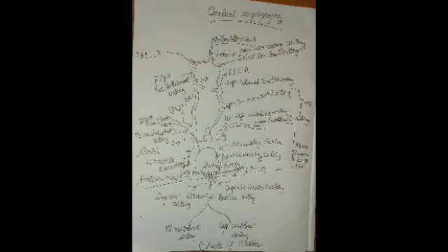When we go for cerebral angiography, basically we look for the arteries forming the COW, that is the circle of Willis. The circle of Willis is the main area where damage happens when a patient meets with a stroke. In the anterior view, we know that from the heart the first branch we get is the ascending aorta, because the largest blood vessel, the artery, is known as the aorta.